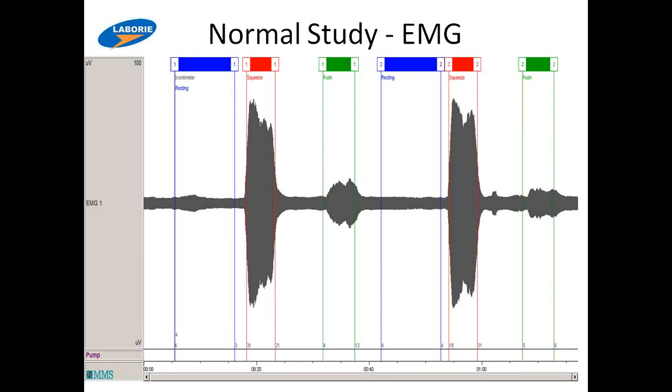So I coached him a little bit, and this is a tip for doing this study I found very useful. When I do the EMGs and you have the two surface electrodes there, they kind of rub against each other, so I put a gauze there. Then I'll tap my finger on top of the gauze, and when he pushes, I expect my finger to be pushed away. If it's not happening, I'll just coach them and say, now you have to relax the pelvic floor. You can use your abdominal muscles, but make like a bellows, push my finger away.